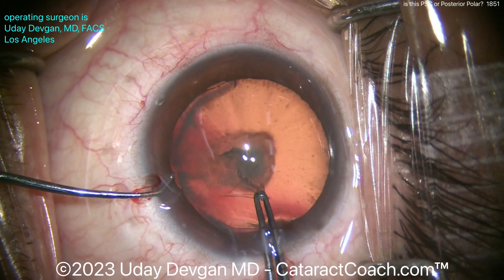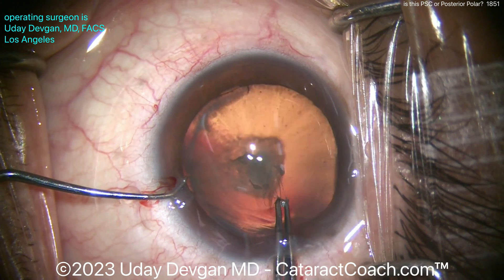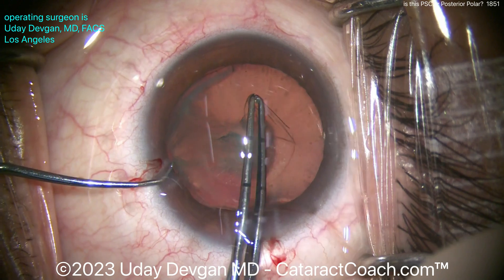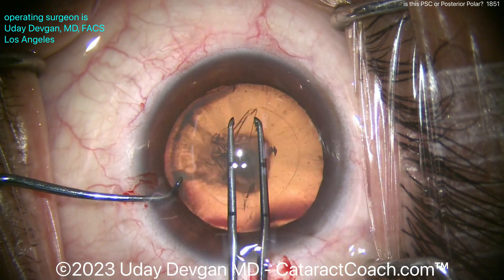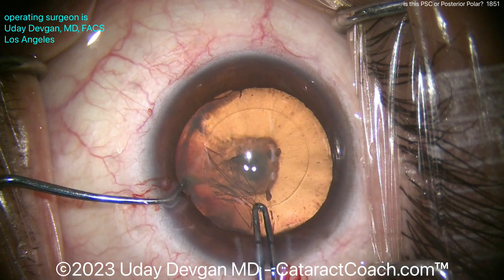I'm measuring again, getting a mental idea with those forceps. My forceps have two marks — one is 2.5mm from the tip, the other is 5mm from the tip — so I can figure out the exact diameter to get a nice 5mm rhexis. Taking my time here, going a little bit slowly, very deliberate, getting that nice round rhexis, beautifully rounded, making sure it's the exact size I want, which is basically 5mm.